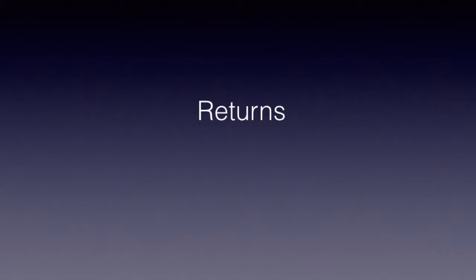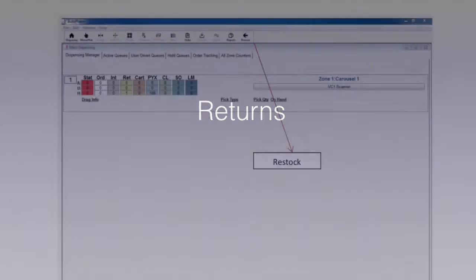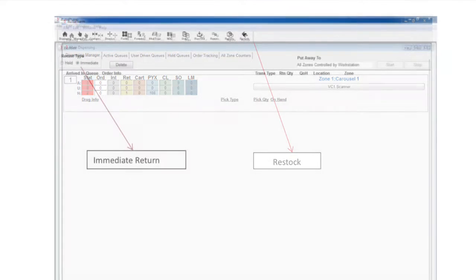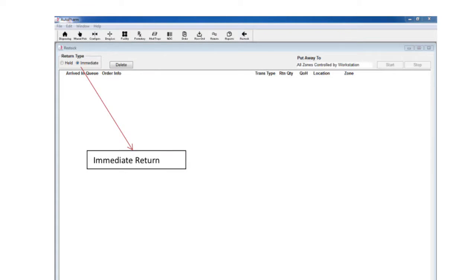To begin the return process, select the restock tab from the dispensing screen. There are two types of returns: held and immediate. Held returns allows the user to create a queue to return multiple items. We generally reserve this function for the inventory control tech to refill the order.